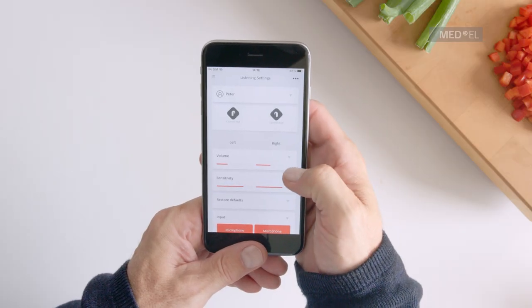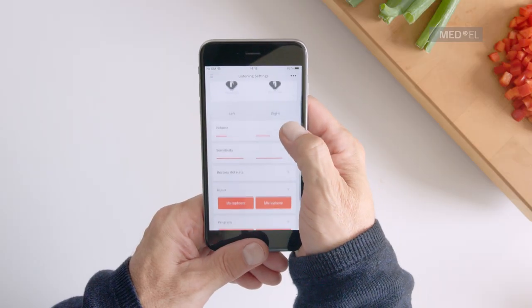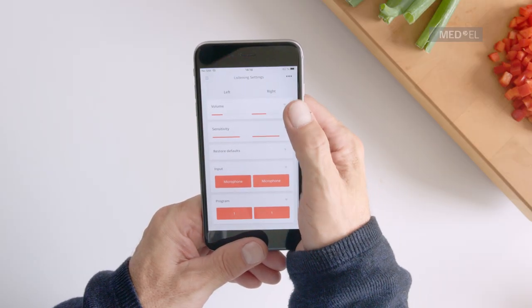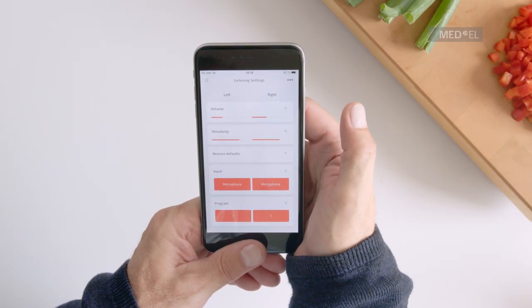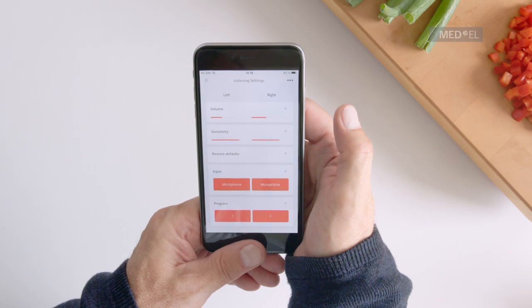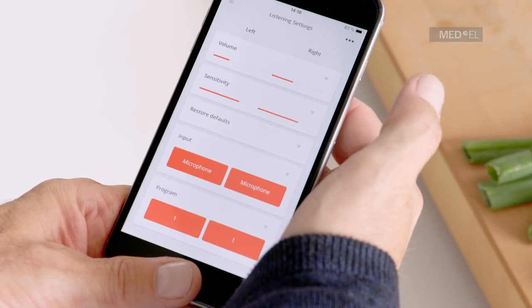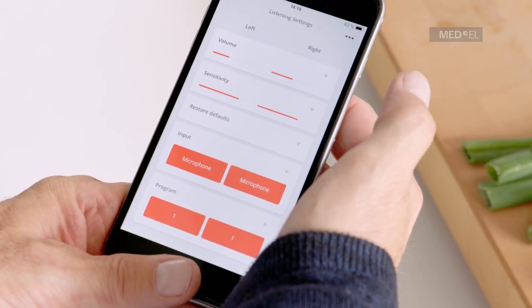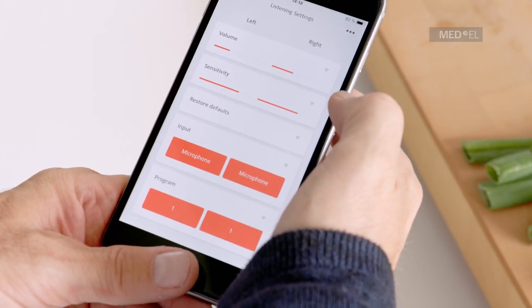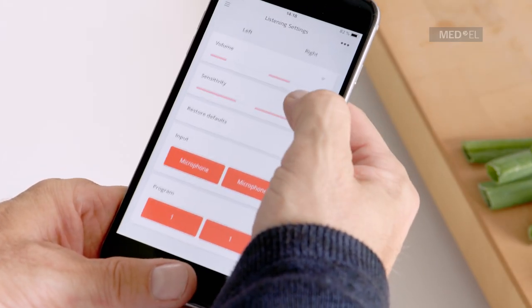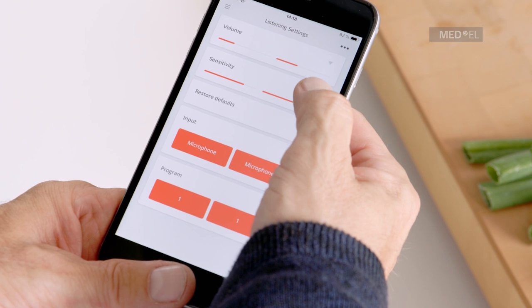You can choose whether to receive input from your audio processor microphone, telecoil, or a mixture of both. And select the program you want to listen with.